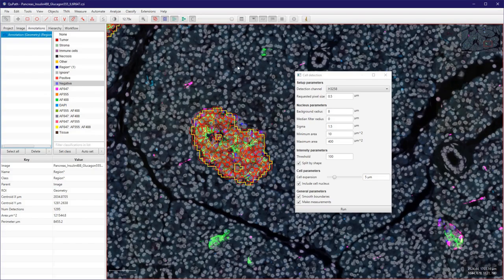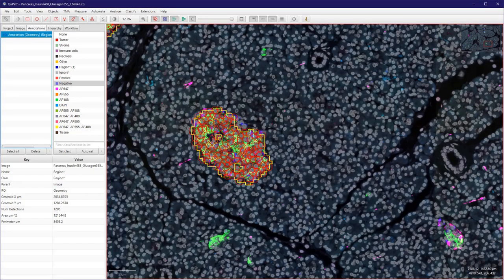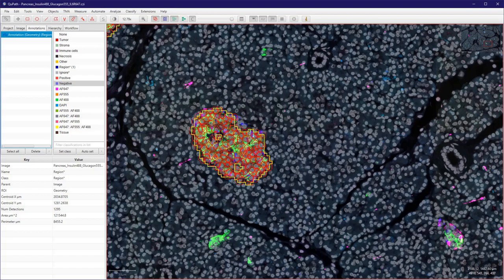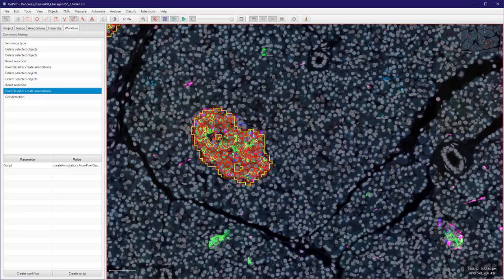So I have detected my cells now, and if I go to the workflow tab you can see several steps from prior starting this video. And the main commands is pixel classifier, create annotations, and cell detection.